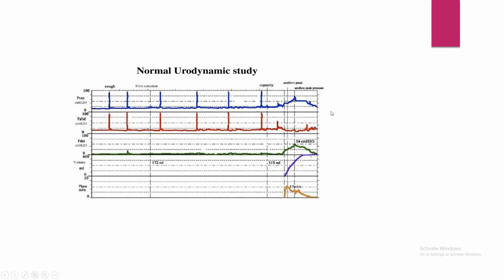So okay, got Yes, it? What is the normal graph? Both filling and yes, voiding. ma'am. Filling is normal, voiding is normal. Got it? Yes, ma'am. Yeah.